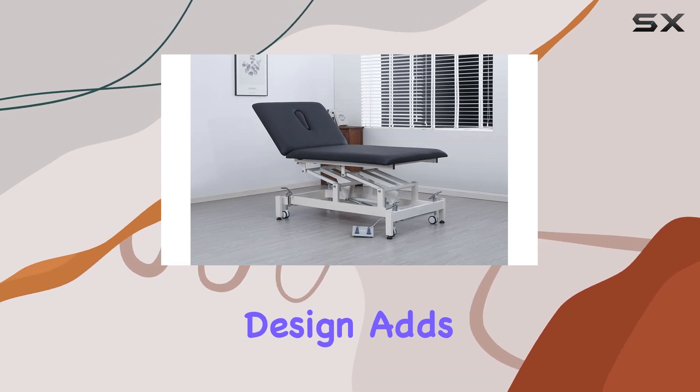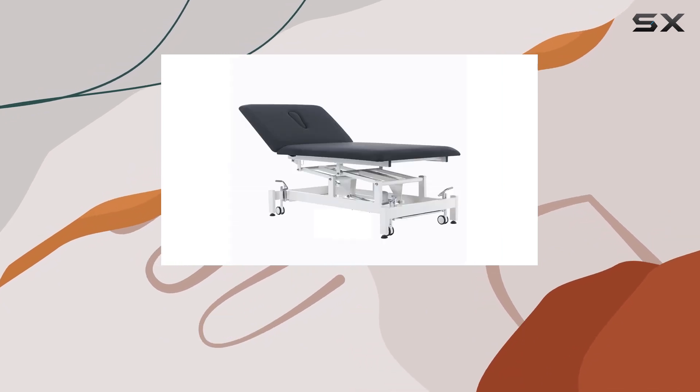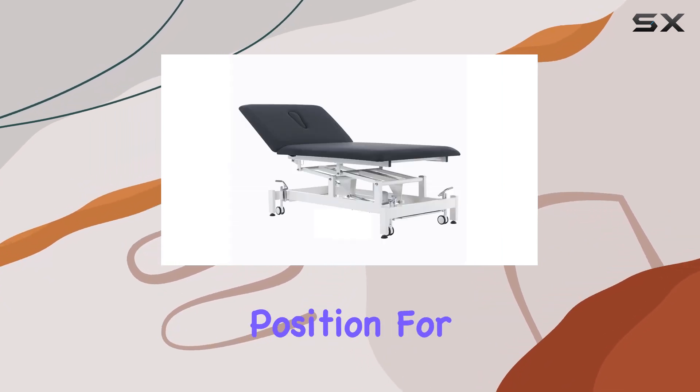The two-section design adds versatility, especially with the adjustable backrests ranging from 0 to 85 degrees, ensuring patients find the optimal position for their therapy.